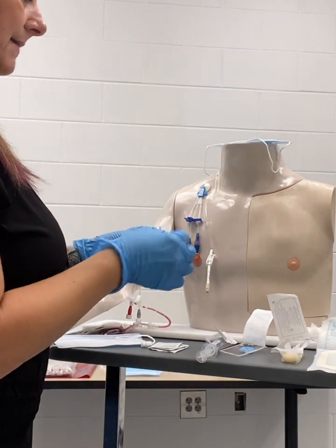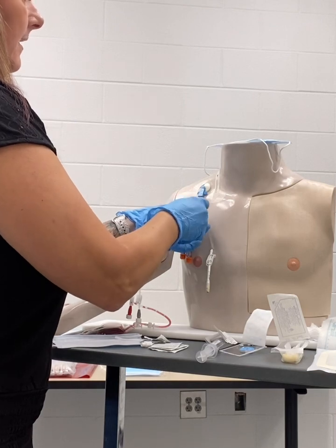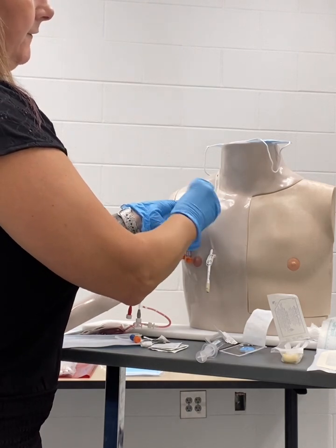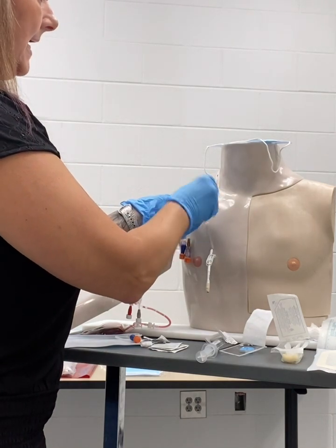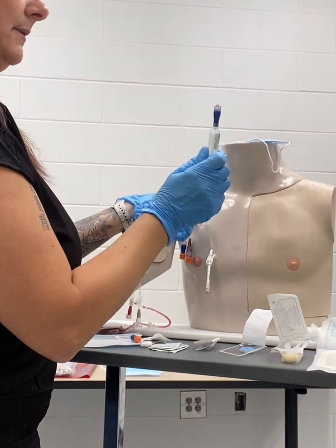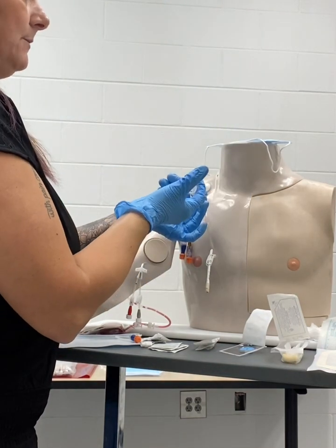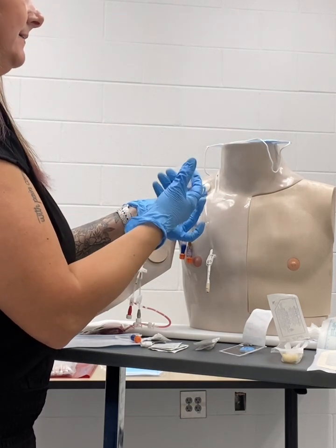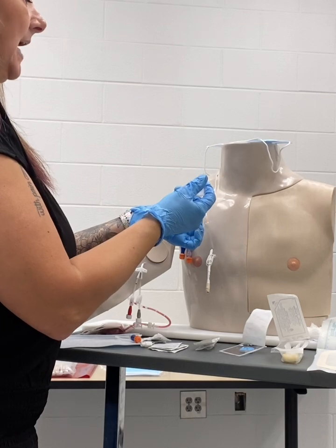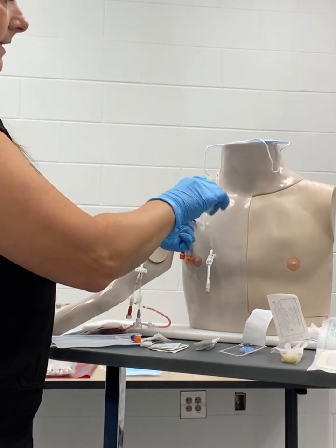With this procedure, I want to open my alcohol prep, and I'm going to start with removing the old cap and tossing it, and I'm going to cleanse the site for 15 to 20 seconds vigorously prior to applying the new cap. Once that is clean, I will get my new cap, maintain the end of that sterile, and apply. I'll unlock my lumen and I'm going to flush and pull back to check for patency, and then continue to flush the entire 10 mLs. Towards the last one to two milliliters, I will clamp while I'm adding positive pressure. This cap is now changed.